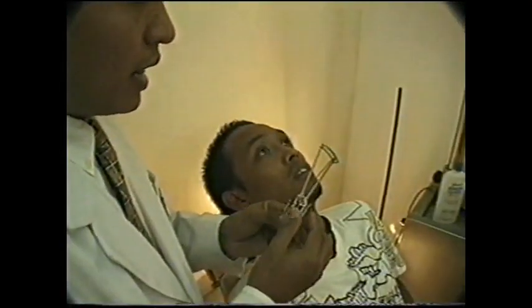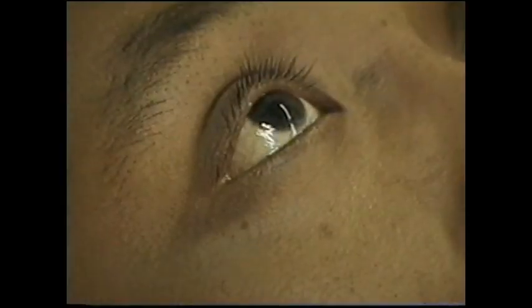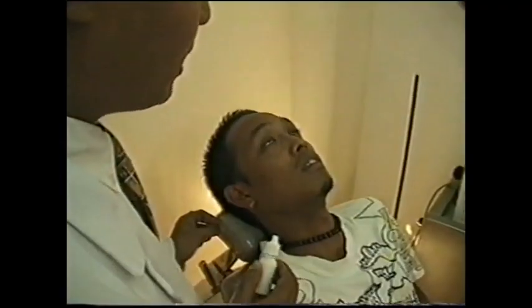This procedure is done with the use of a topical anesthetic. Make sure that your patient is positioned in a semi-reclined position with his head almost horizontal, and instruct your patient to fixate on the ceiling while you perform the examination.